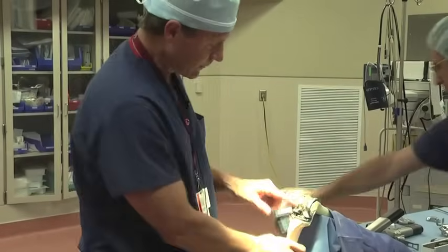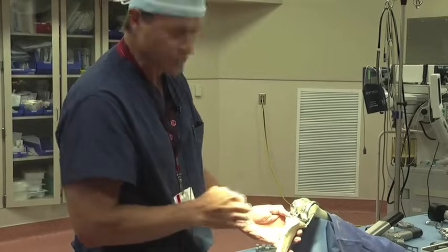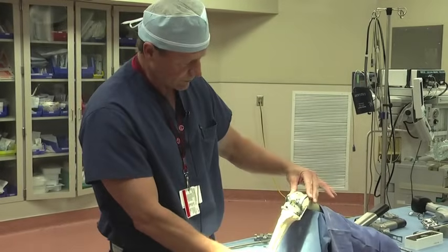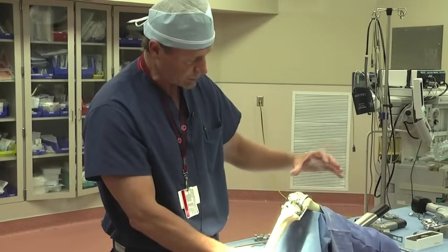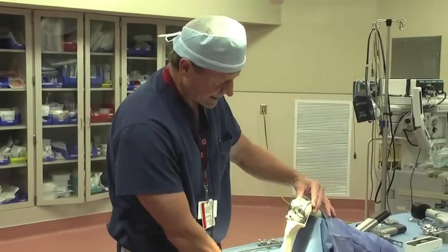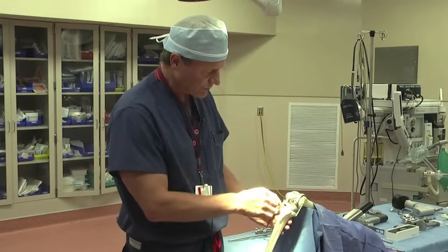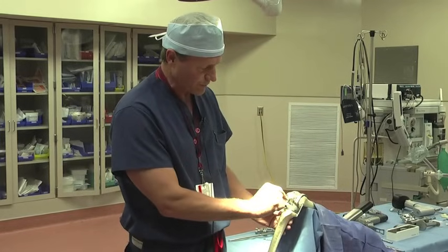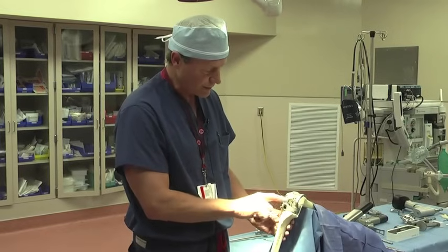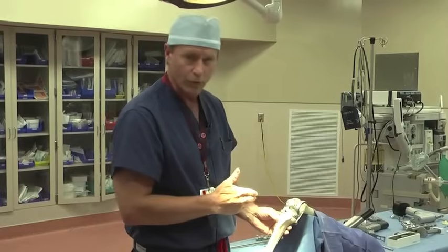Now the femur is completely prepared and we have to determine what size polyethylene component — the piece that fits between the two metal components — will be. We'll snap this into place and then we have our trial implant on. We'll drop the kneecap back into place, take our retractors out, and put this knee through a range of motion — making sure we can get it fully straight and fully bent. We check the stability of the knee, ensuring it's all stable within the constraints of the ligament. We have the ability to pop this component out and go with a thicker piece. Once we figure that out, we know the size of our femoral component, our tibial component, the polyethylene that goes in between, and our plastic button for the patella.